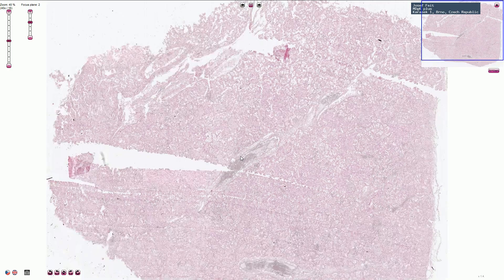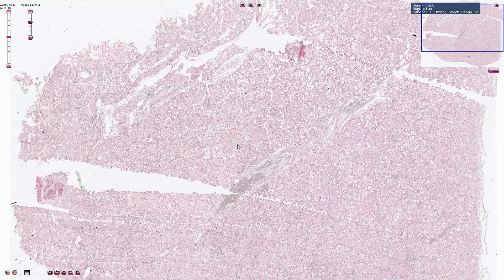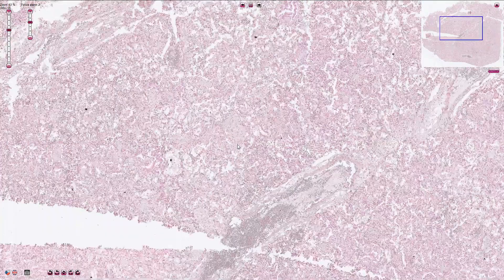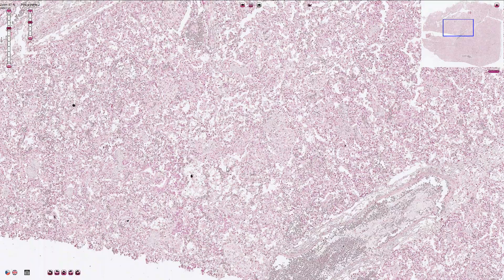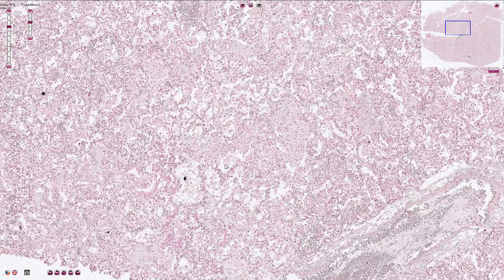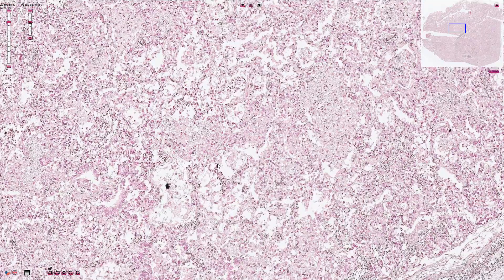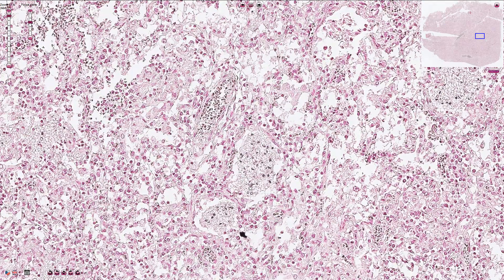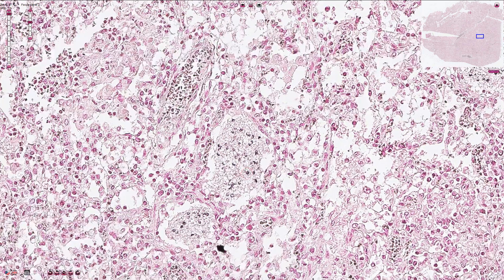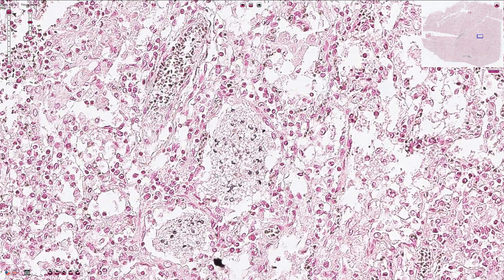This second slide is stained by Grocott stain, which stains positively all fungal microorganisms. Here in this alveolus we can find the bubbly frothy exudate together with positive crescent-like trophozoites and also round cysts with dark staining central dots.